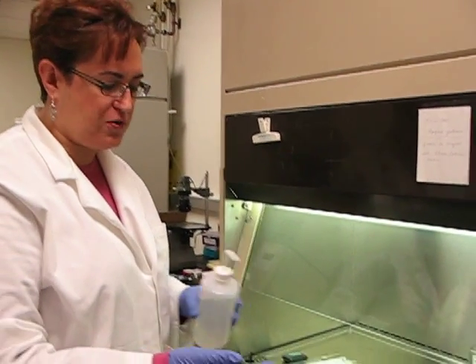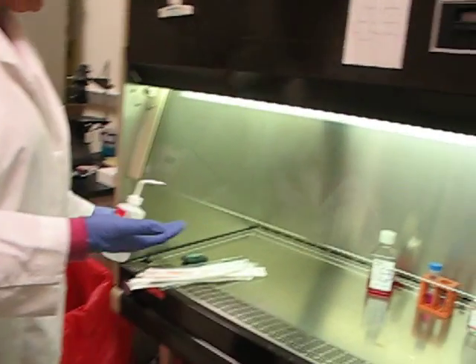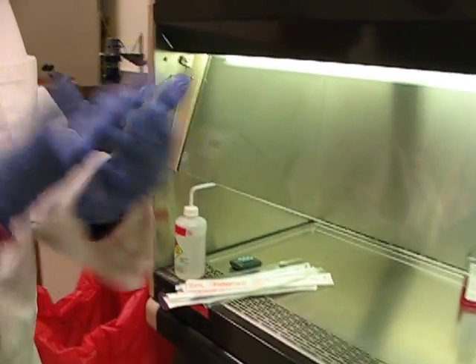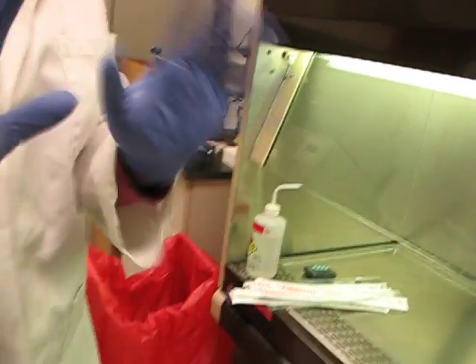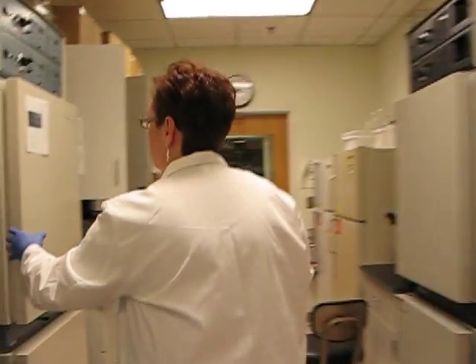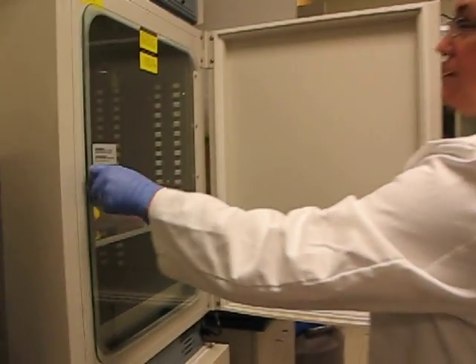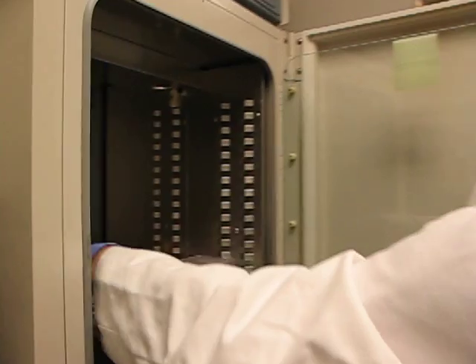We're ready to start subculturing. First thing I do, because we're going to be touching our flasks, is put a little ethanol on my gloves, wet them down, go to the incubator, and grab my flask of cells.